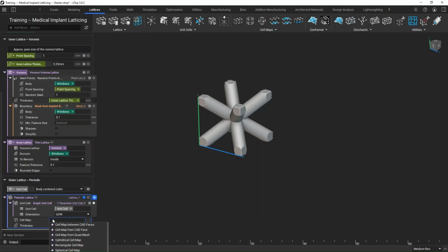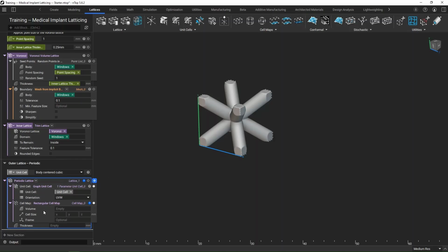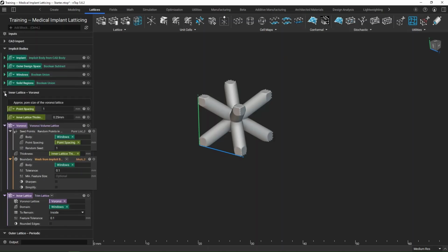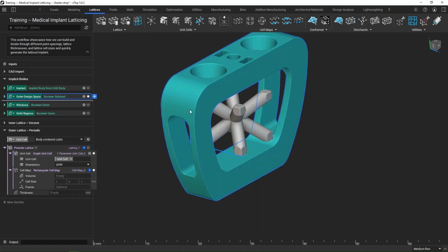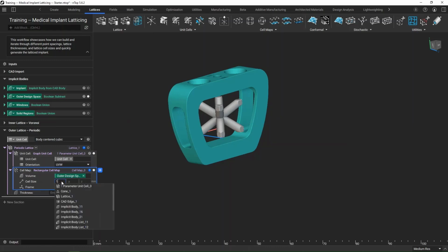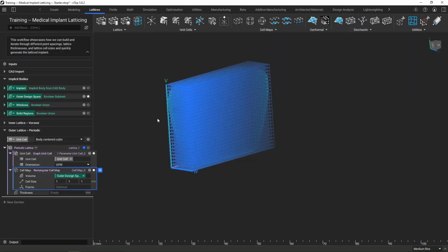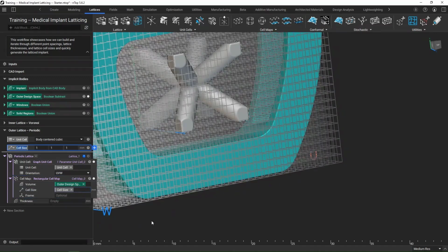So next up, we need a cell map. I can do that double click method. We'll keep it simple and just go with a rectangular cell map. And we have a couple more inputs to play around with. So first, we're looking for a volume. I can close this since we're done with that workflow for now. And in this case, we want that outer design space, right? We want to be able to fill this volume with this unit cell. Not at that size, but we'll size it down from there. But I can go ahead, drag this into that volume, and then we want to define that cell size. So I'll just start with 1 by 1 by 1. Maybe in the future we'll play around with that. We can see how it's going to fill that region. Let's go ahead, make this a variable too.